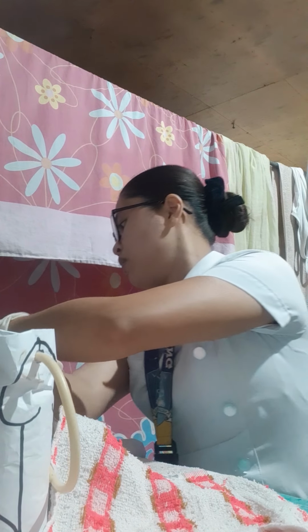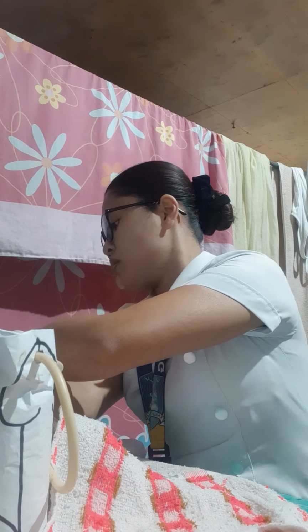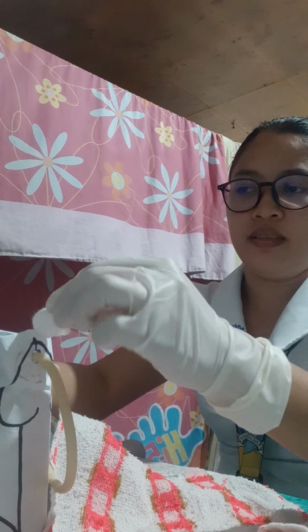Then use clean cotton balls to wipe in a circular motion around the meatus and glans.